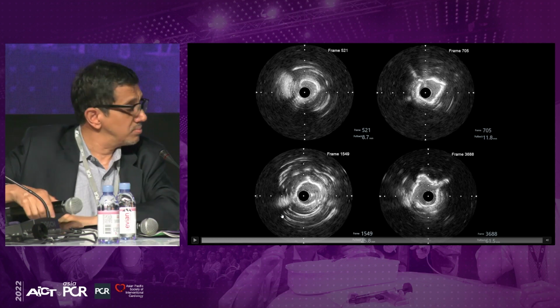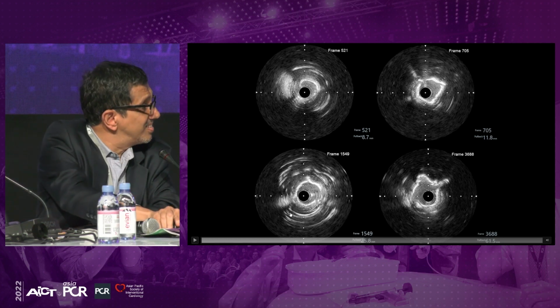Indeed, there are many ways to skin a cat, I always say. So we have shockwave, we have the OPN balloon, we think about upsizing. So, go ahead, tell us what you did. Did you take an orthogonal view? Was there any other view to suggest a residual waist? Or are we ready to do something else?